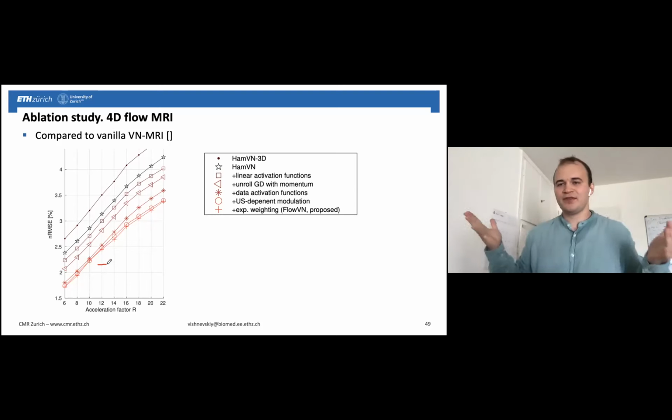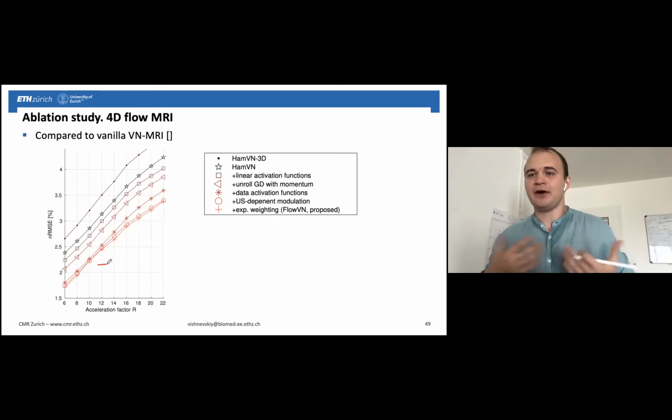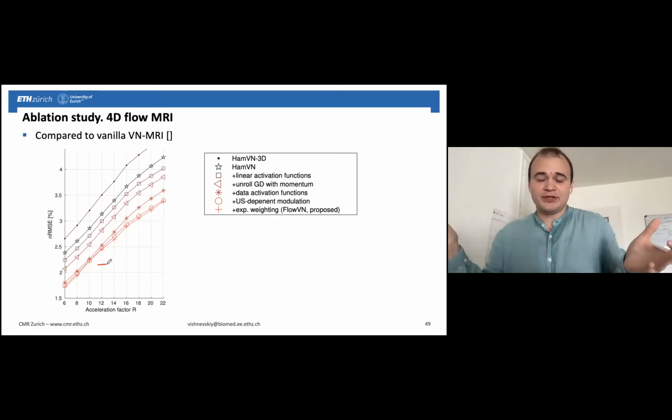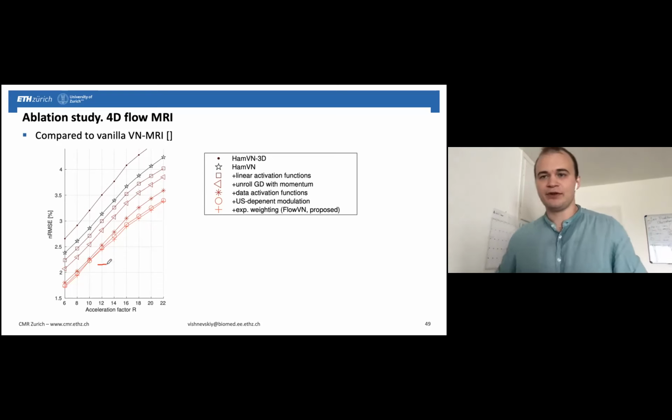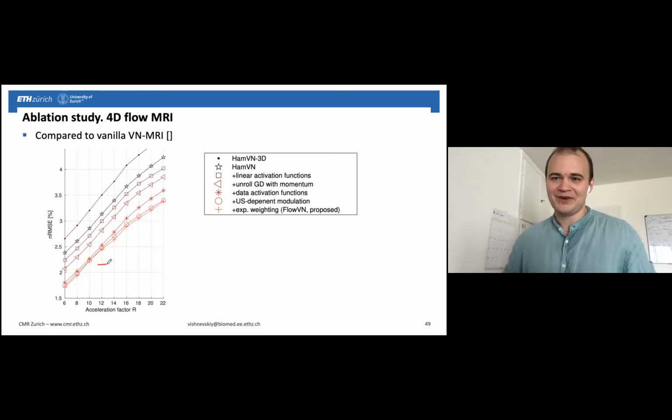But of course, if, for example, you have not flow data but just a beating heart, you can think that you don't want an image of the heart, but just a segmentation of the heart. And then there were works that show that you can go to an acceleration rate around 100. So something very awful, but quite cool.